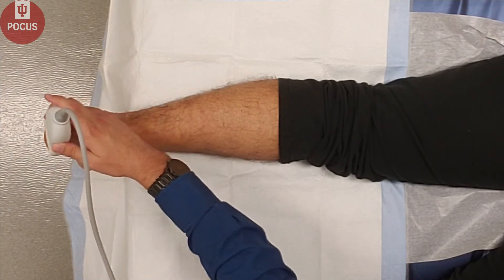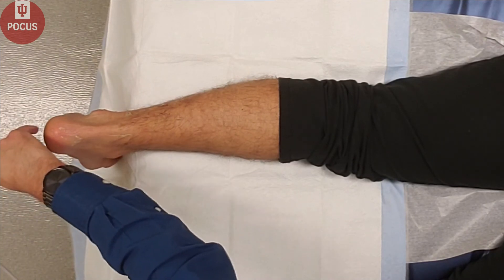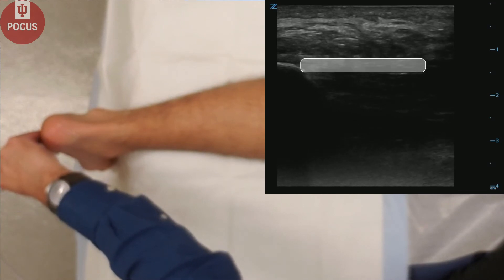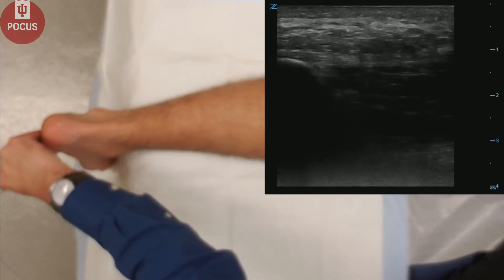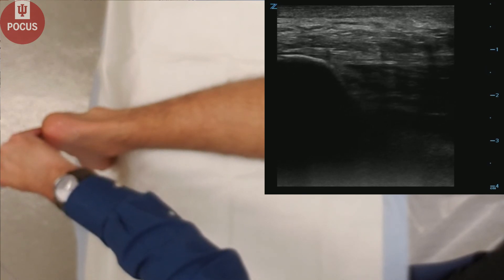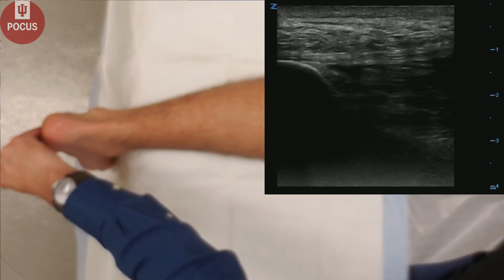Finally, we'll take the ultrasound and place it on the heel in a longitudinal fashion, looking at the plantar fascia, which comes off of the calcaneus here. We can measure the plantar fascia to determine if there's any thickening and signs of plantar fasciitis, and assess for pain and tenderness on the plantar fascia.